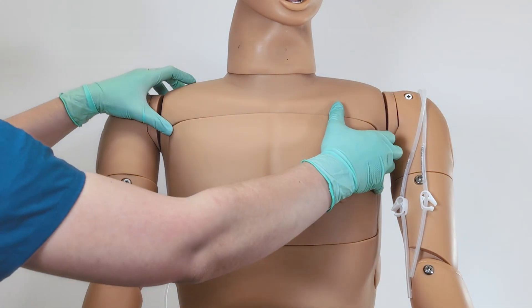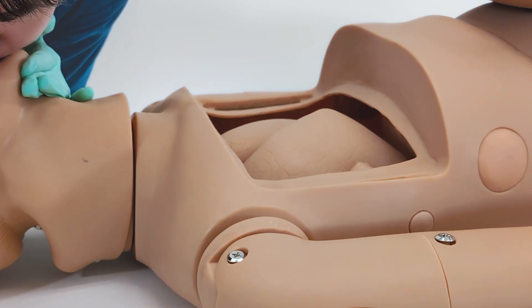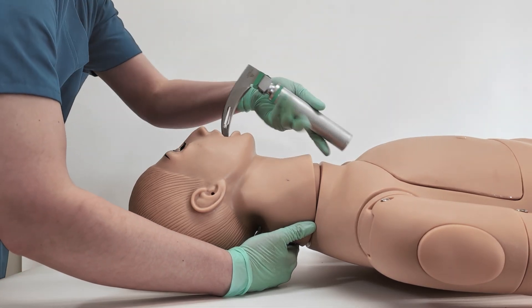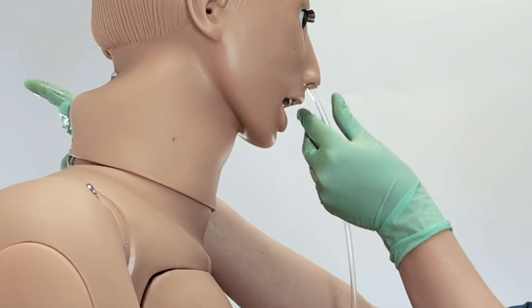For nasogastric education, this model includes a functional stomach, inflatable lungs, tiltable head, a flexible tongue, and teeth for the practice of intubation, nasogastric tube insertion, gastric lavage, and more.